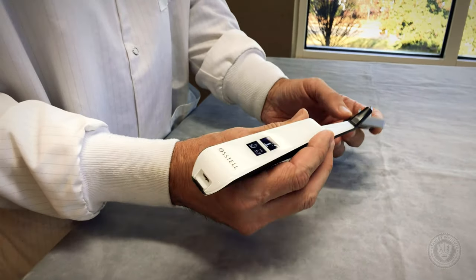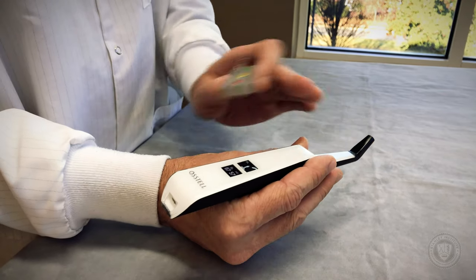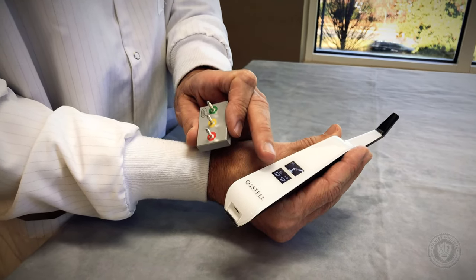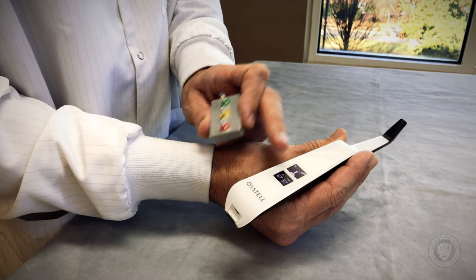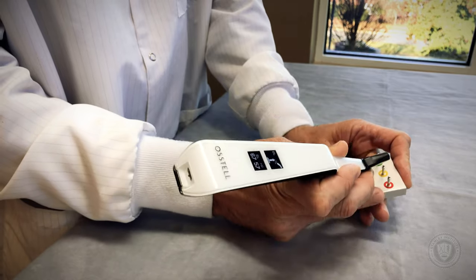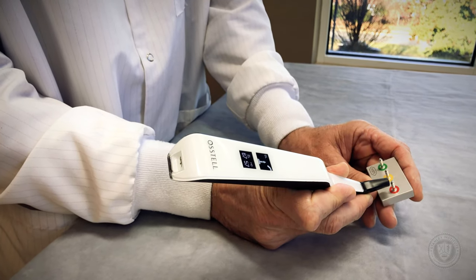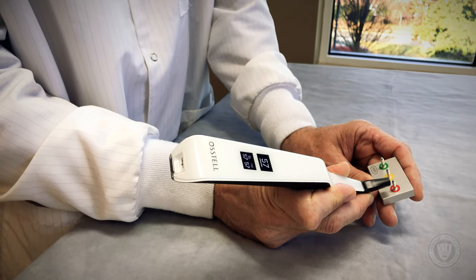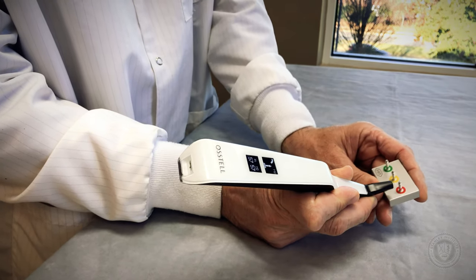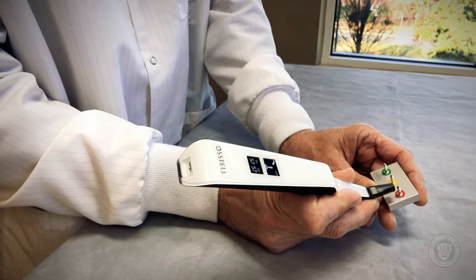But here's really what I like about it. In the previous versions of the Austell, you would just get a metric, a number that tells you how well your implant is integrated to the bone. Now if we come up to the test pin and hold it close, it turns red. Red is warning — we're at a 57 reading, meaning it's not integrated very well at this point.